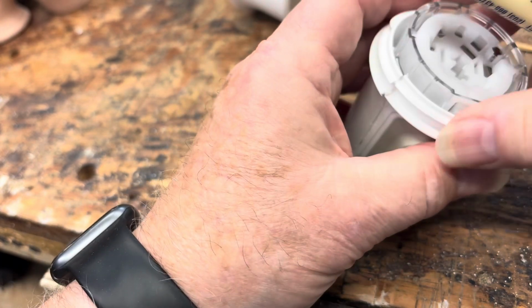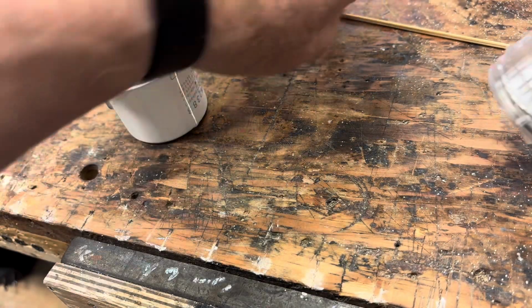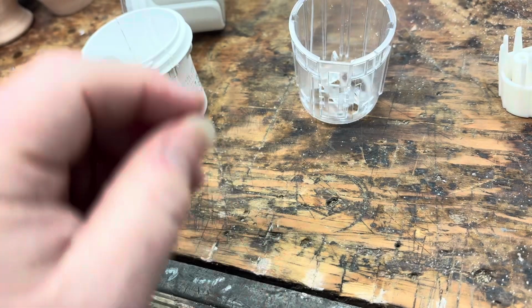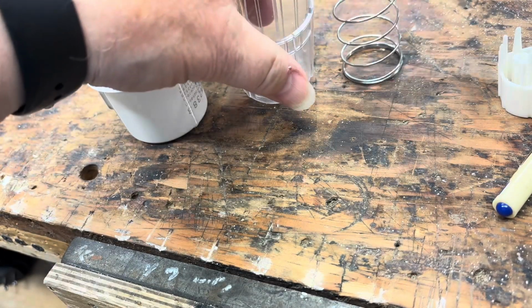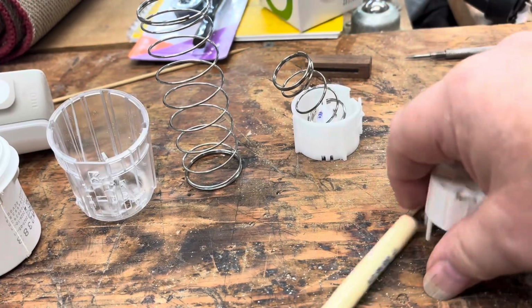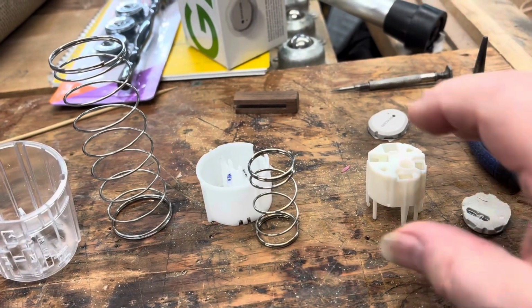There's 4 cups involved. The outer cup, I'll call it cup 1. Cup 2 is this plastic cup. There's a spring between cup 2 and cup 3. This is the 3 and 4 unit. Cup 3, there's a spring between 3 and 4. Spring. And cup 4.